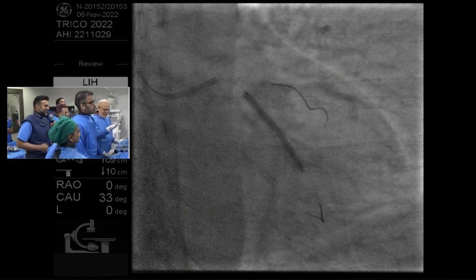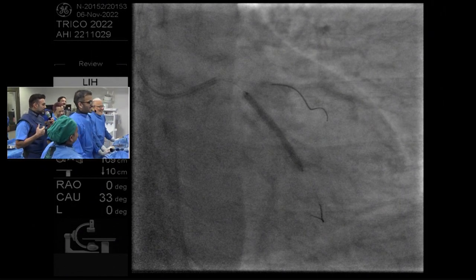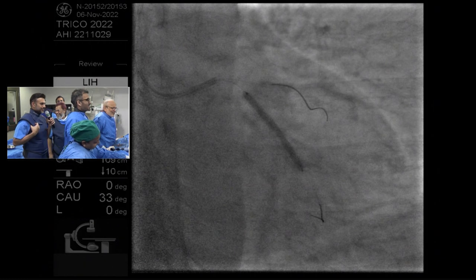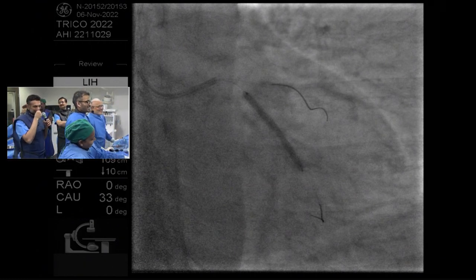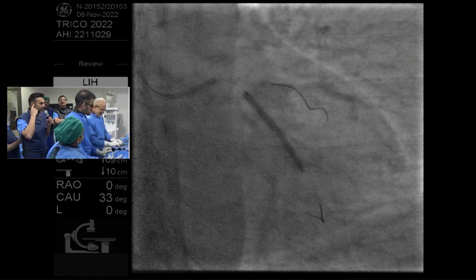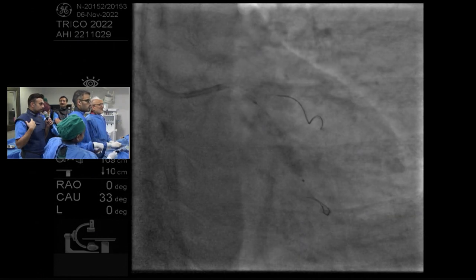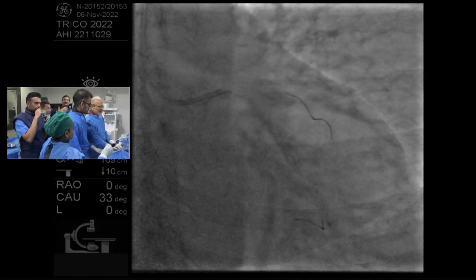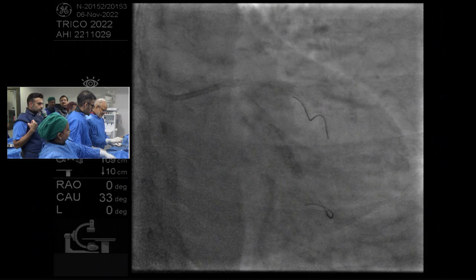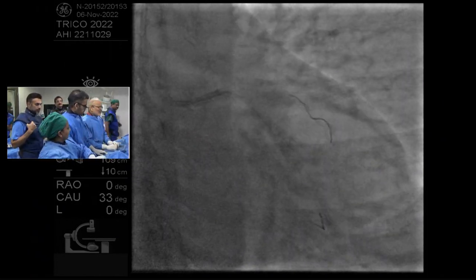We have 5 more minutes and we'll finish. I don't have an IVUS eye. Yeah, and me neither. That's why I use the IVUS. You are like me, old eye, Samir. I think I would IVUS it and see what it looks like before the balloon. For what it's worth, I would take a 3-0 NC balloon proximally because it's not about expansion alone there. It's about sizing too, right? And there's a size issue. It's a bigger vessel proximally than it is distally.